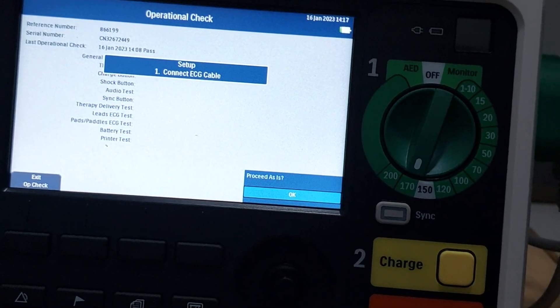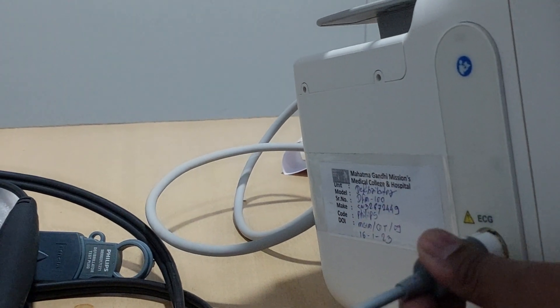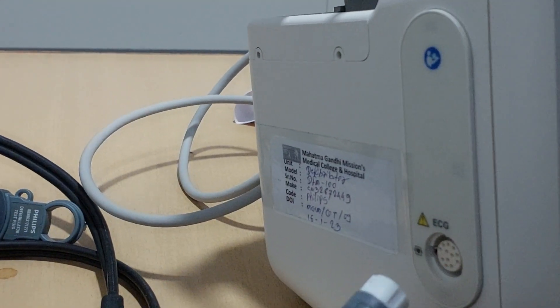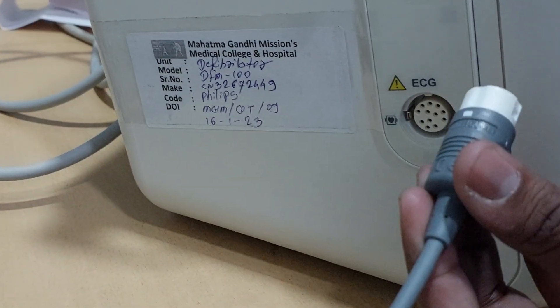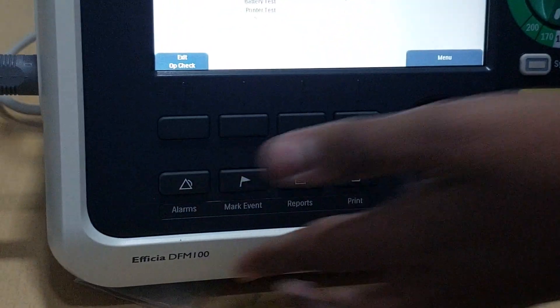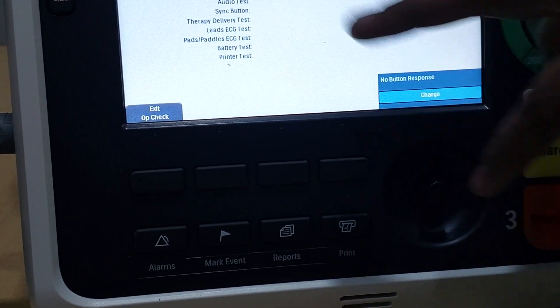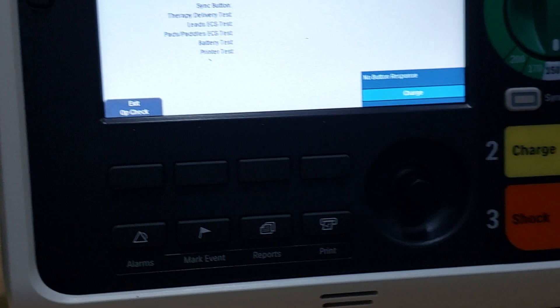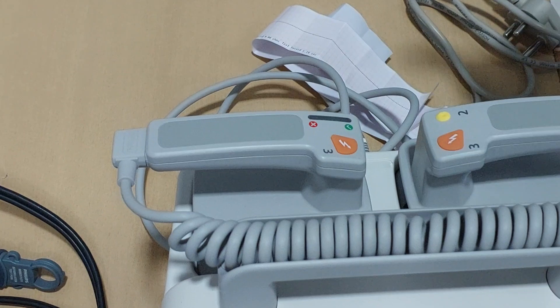The next instruction says: 'Connect ECG cable'. This is the ECG cable — you connect the ECG cable here using the knob connection. After connecting, the next instruction says: 'Turn knob to 150' — set the therapy knob to 150. Then press the charge button to charge the machine.